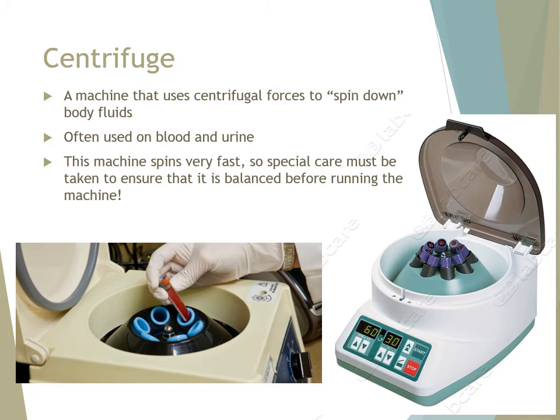One of the machines that is used during surgery, well, in the preparation for surgery, is to look at the blood status. So one of the ways that we use is to have our blood centrifuge, so we'll be able to count the blood components.